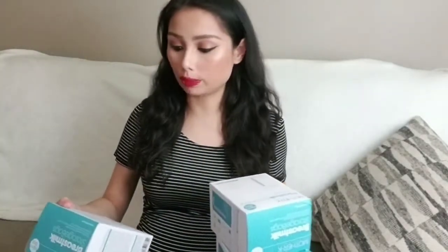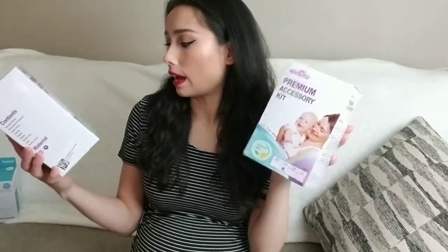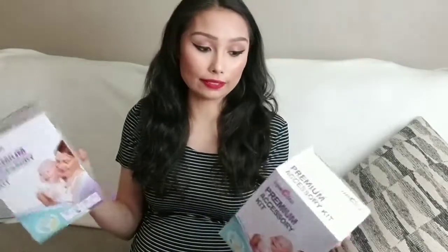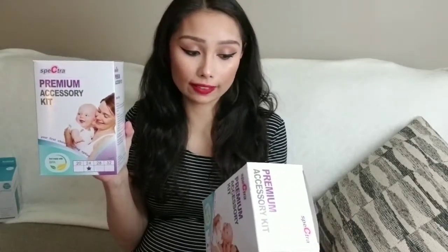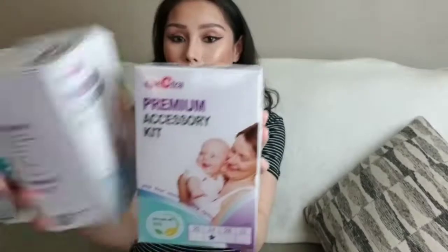First there are three packs of breast milk storage bags by Mother K — 50 bags each, 10 ounces. Next are two Spectra Premium Accessories Kits. I didn't know what size to get so I went with 24 millimeters. Each kit includes a breast shield, backflow protector, valve, head tubing, nipple, bottle, bottle cap, disc, and bottle cover — all silicone. There's a bunch of stuff in there.